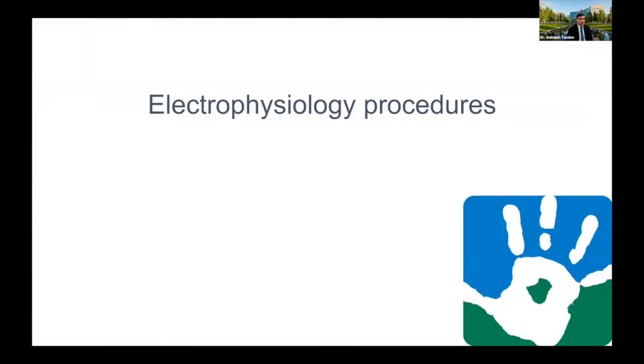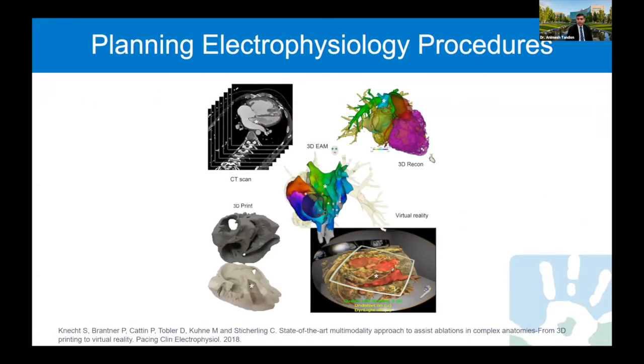Dr. Adebo mentioned this briefly, but there is use of 3D imaging in electrophysiology procedures. He showed the overlay of the CT, and there are actually other case reports about using 3D printing and virtual reality and augmented reality for both planning and intraoperative guidance.